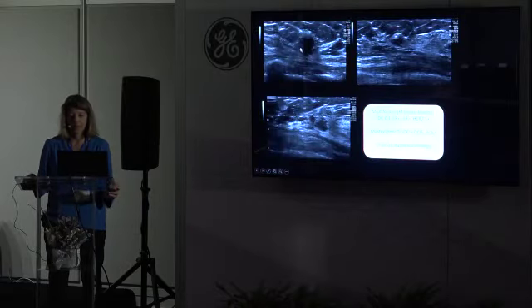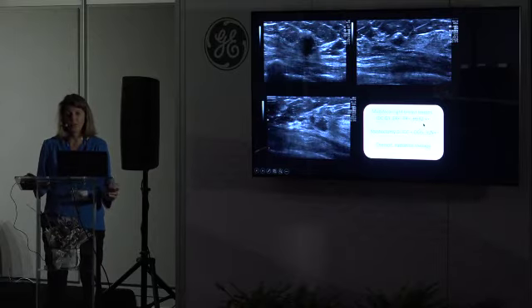And we found at least three additional lesions on ultrasound, of course very suspicious with irregular margins, and here very small ones. And finally, it was a HER2 positive grade 3 lesion, very aggressive. And she had a mastectomy, and she also had DCIS.